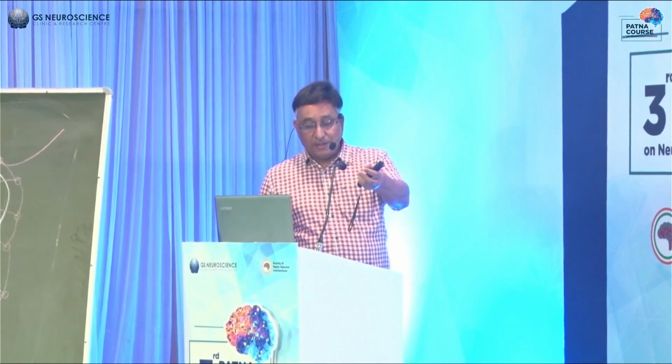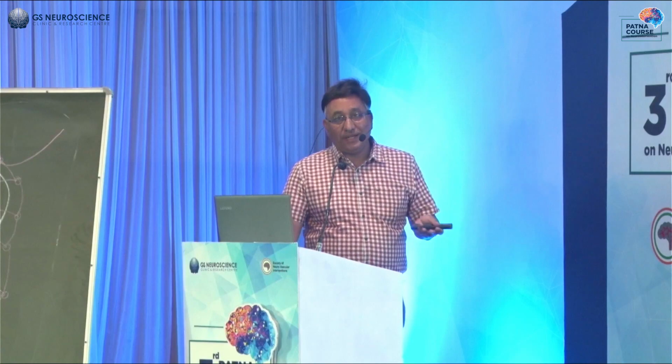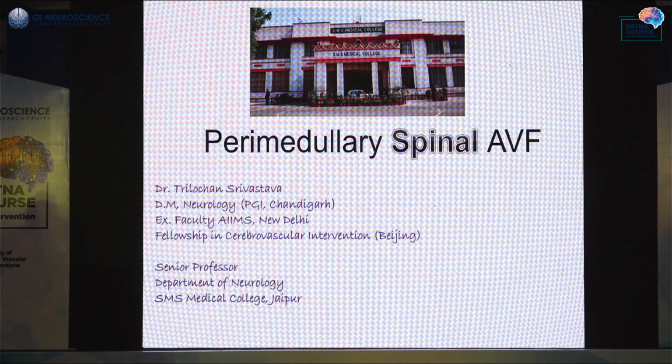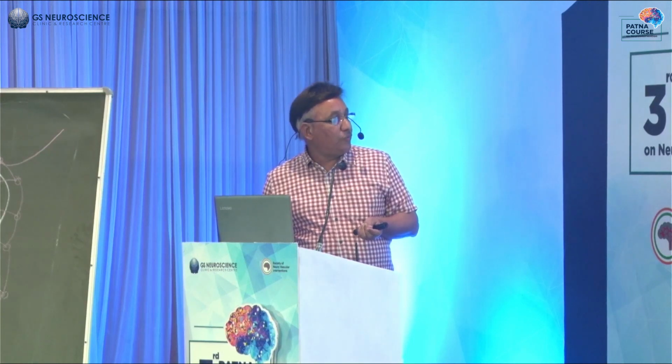And I discussed this case with Dr. Rahul after the angiogram. He was an 8-year-old child, and we thought we would do only DSA, but because he was 8 years old we did DSA under GA. After the procedure, I discussed this case with Dr. Rahul. He belongs to somewhere in Bihar, and we embolized this case. Perimedullary fistulas are not very common to find.